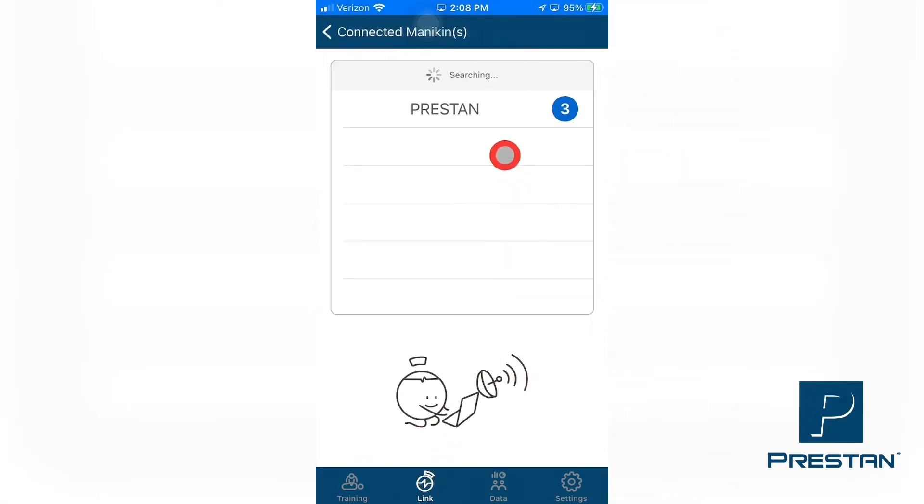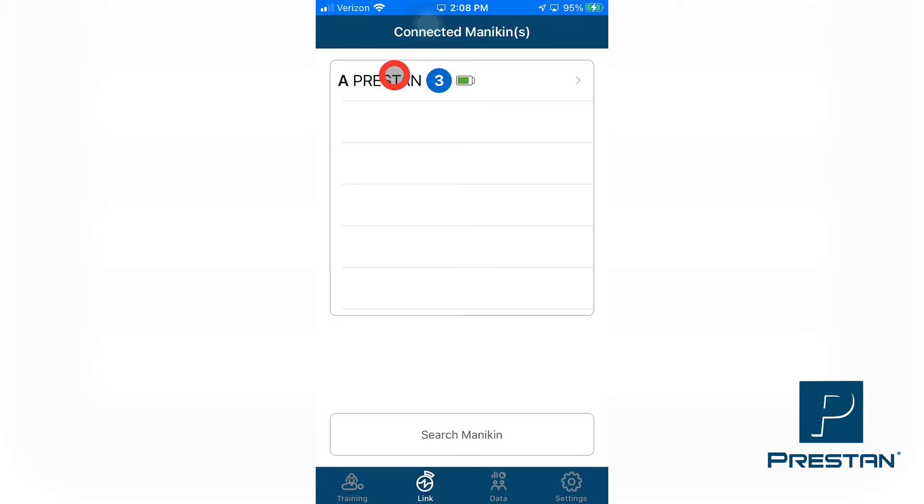A list of connected mannequins will appear. Select the desired mannequin from the list, and ensure that a checkmark appears next to the name of the selected mannequin. Then select Connected Mannequins and select the chosen mannequin from the list.